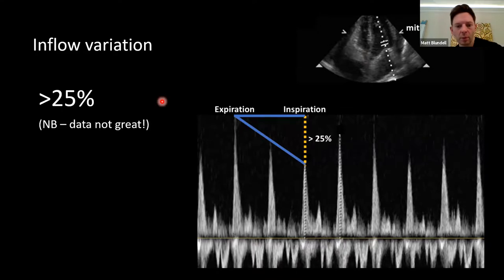So you'll see this in someone with COPD, with asthma, with PE, other forms of constrictive pericarditis. Even if you get someone to breathe at vital capacity, you often see this finding. But if you see someone who's breathing at normal tidal volumes and you're worried about tamponade, so you're looking for this change, this is a bit more advanced stuff, which is something to be aware of.